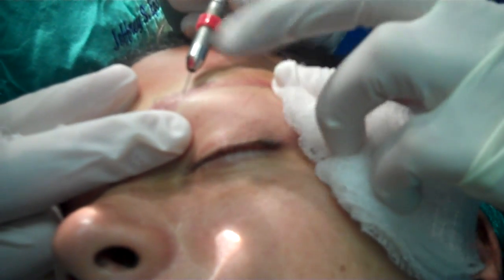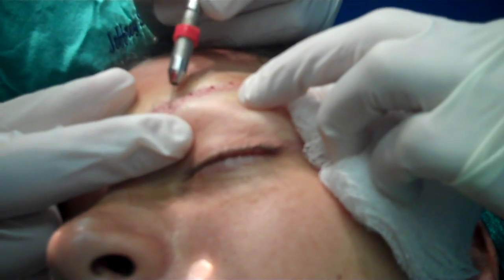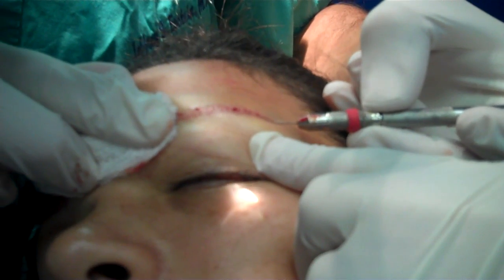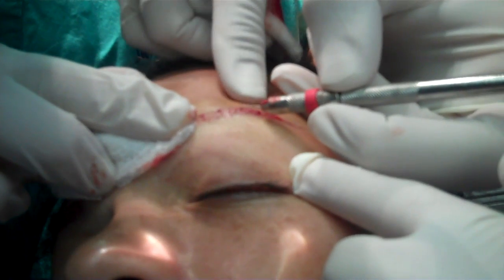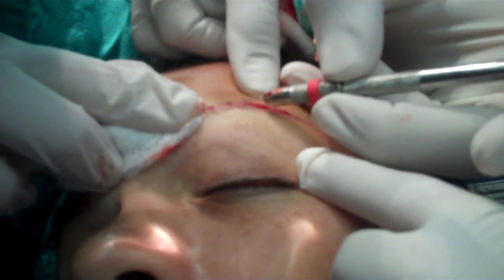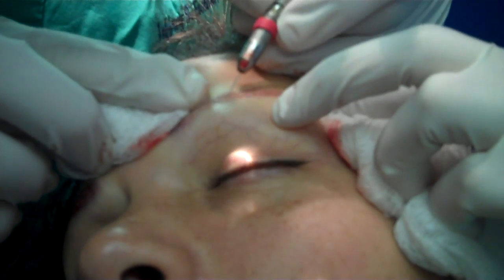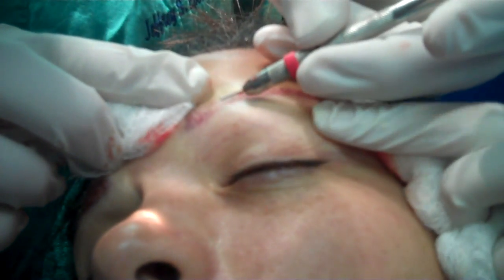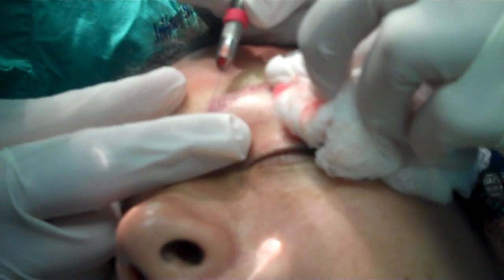As we proceed more medially, this is where the two-hair grafts are going to stop. Then I'll go back to my 0.5 mm recipient site and just do some filling in, making more recipient sites to finish up this section.